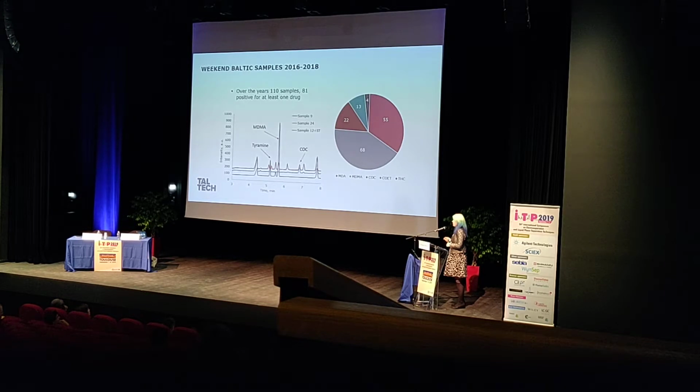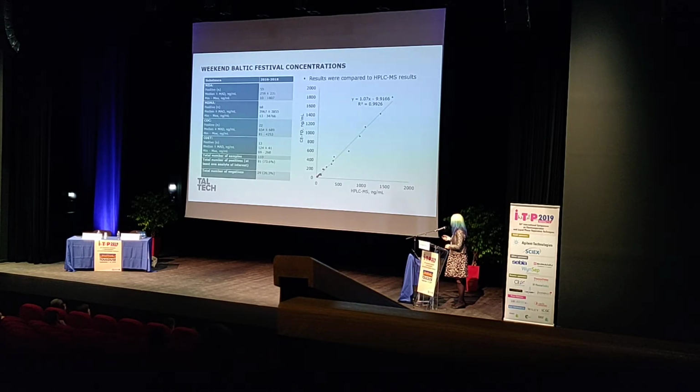THC was measured using a different methodology, which was also usable with this machine. We didn't find any amphetamine or methamphetamine, but that was due to the lack of sensitivity of the limits of detection. The results were also quantified for MDA, MDMA, cocaine, and cocaethylene throughout the years, with MDMA having quite a wide range, because the people were actually brought from the festival itself, so the intake was quite recent.